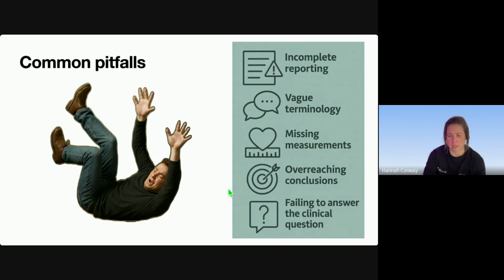pathology. Don't use any vague pathology, and what I mean by that is, rather than sort of hedging your bets and saying there's a possible effusion, with the level of detail that you get with TOE, you really should be saying yes there is, or no there isn't. And I think that's fair to say. So, you know, utilizing something like small circumferential pericardial effusion without any chamber collapse would be more appropriate at this level and with this tool.